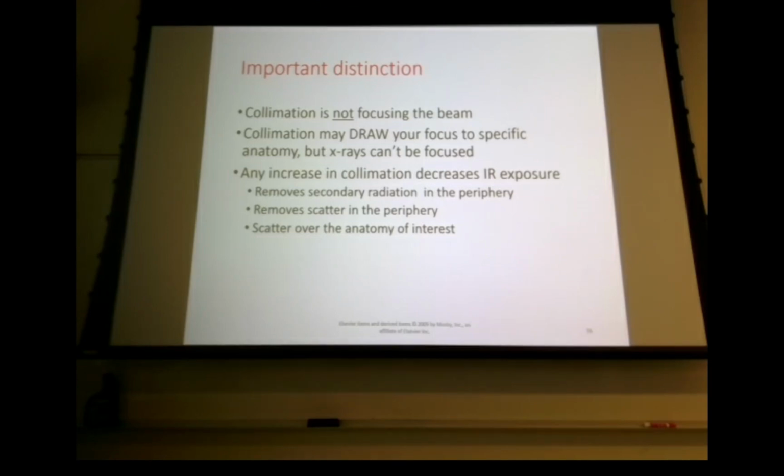We're not focusing, and I think part of the confusion comes in whenever people use the terminology, well, we're going to collimate down so that we can focus on the L spine. Well, that's focusing your eyes on the L spine as opposed to the overall abdomen. But that's not the same as focus in the stream of X-rays.